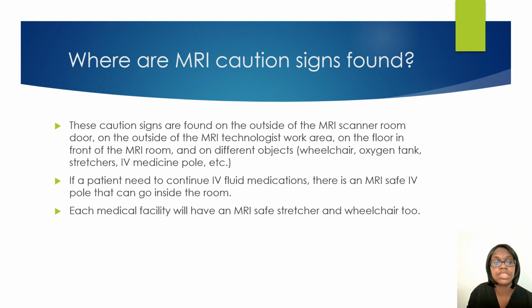Each medical facility will have an MRI safe stretcher and wheelchair. So just make sure you're using the correct stretcher. Or if you have a transporter or someone bringing down a patient, make sure they are bringing them down on that MRI safe stretcher or wheelchair.